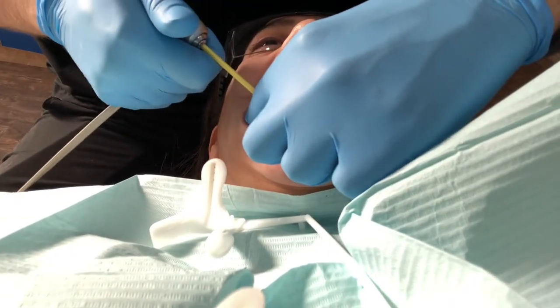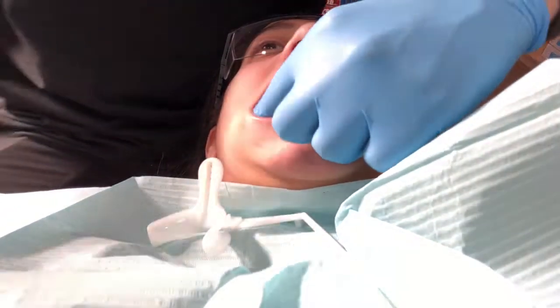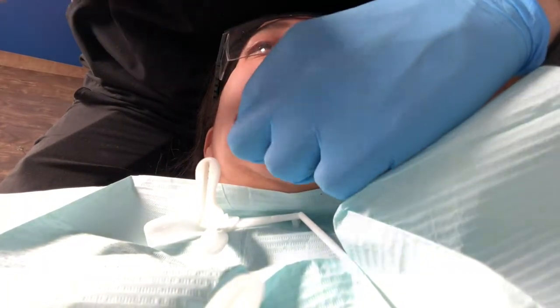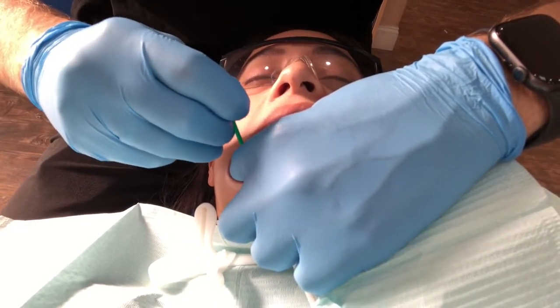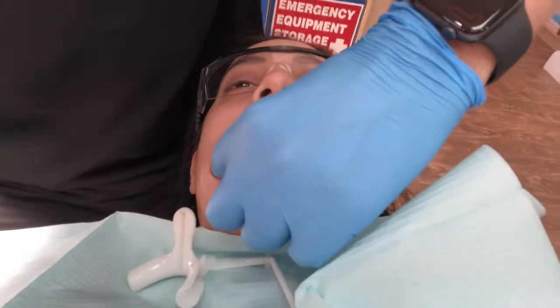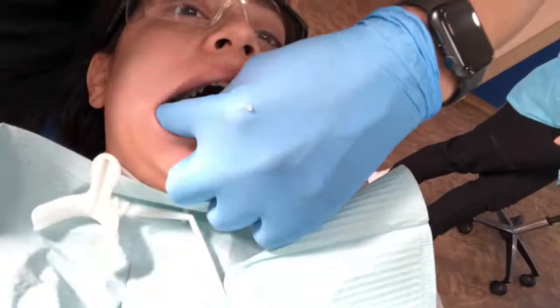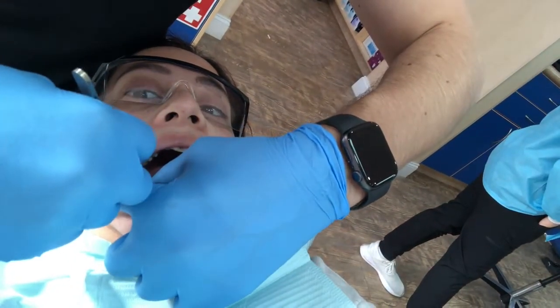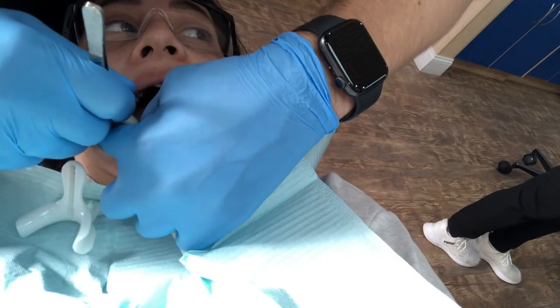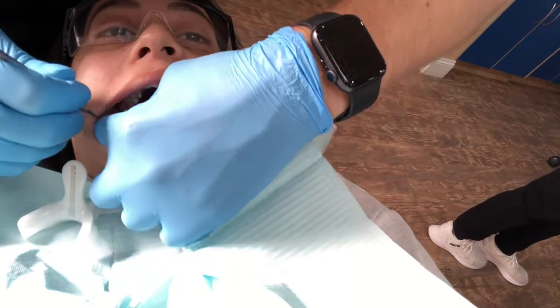This last part is when he is attaching an anchor to my wisdom tooth. With my trays I have to wear a rubber band, and that's what he's gonna put onto my wisdom tooth — it's a metal anchor. It attaches on the side, and on my upper trays there's a hook where I'll place the rubber band, then place the bottom half onto the anchor. That's gonna help with moving my teeth so that my midline is aligned properly over time.